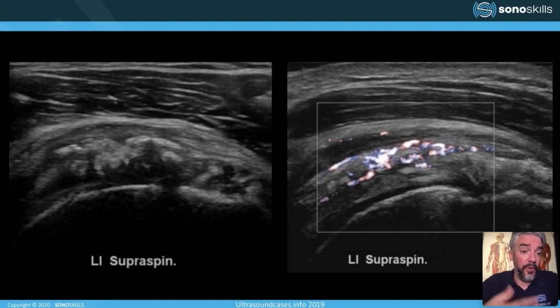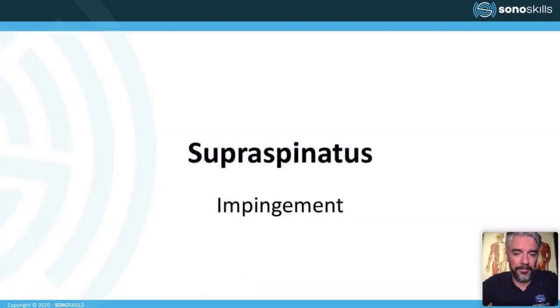In this case, this is a severe case of a calcific tendinopathy. We can see a lot of scattering of calcifications throughout the tendon, some being softer, type 3, some being harder, type 1. And in this case, with Doppler imaging, we can see a clear positive Doppler signal.